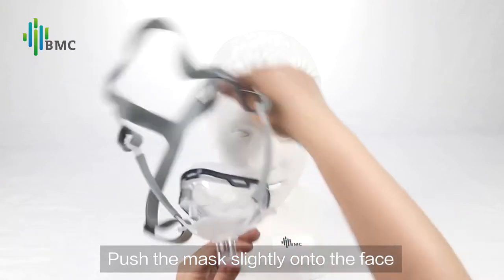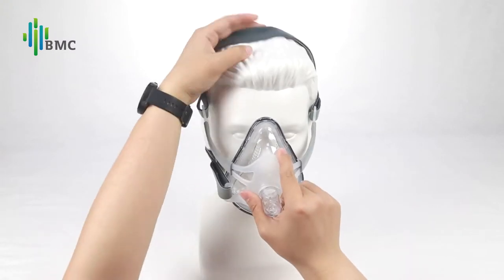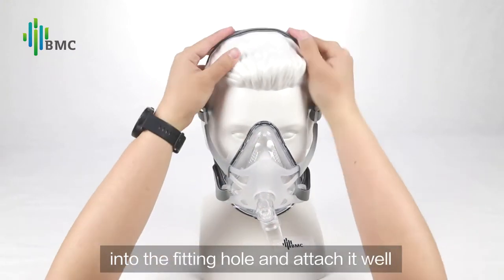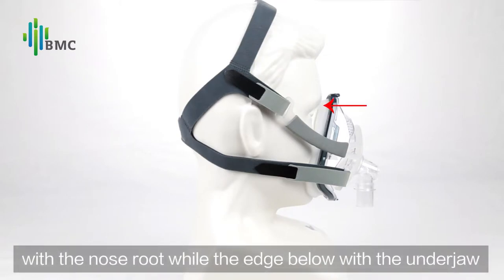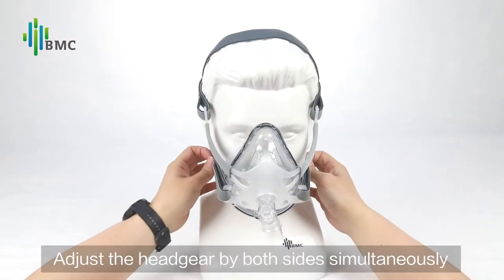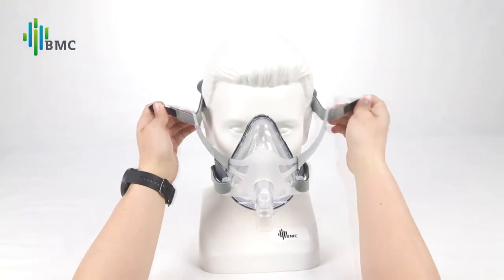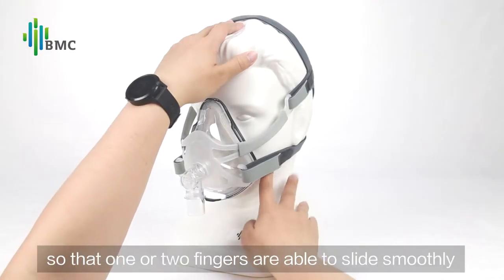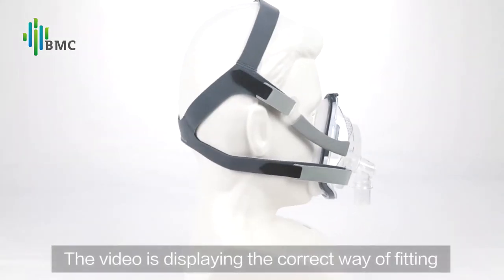Mask Fitting: push the mask slightly onto the face. Pull the headgear over the top of the head. Put the other end of the headgear into the fitting hole and attach it well. The upper edge of the cushion should be aligned with the nose root while the edge below aligns with the underjaw. Adjust the headgear on both sides simultaneously so that one or two fingers are able to slide smoothly.